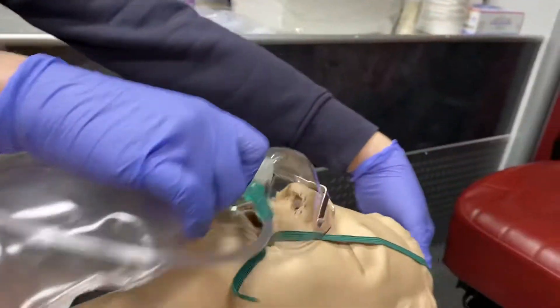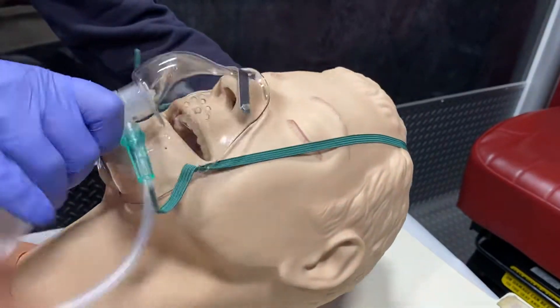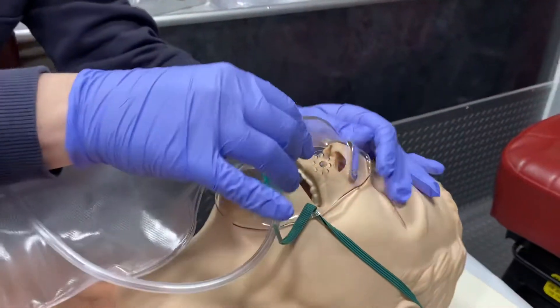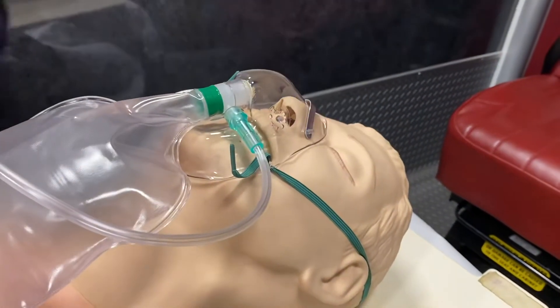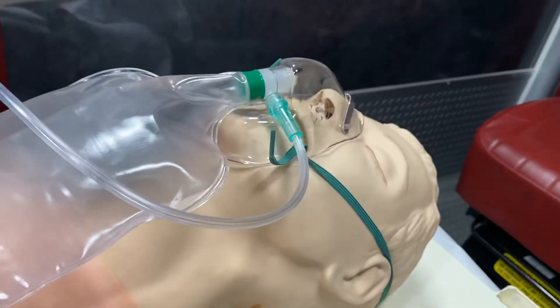When you put this on, you're going to place it over their nose and mouth. The straps will go behind their ears. Then I just try to make this as comfortable as possible for the patient by adjusting it over their nose.